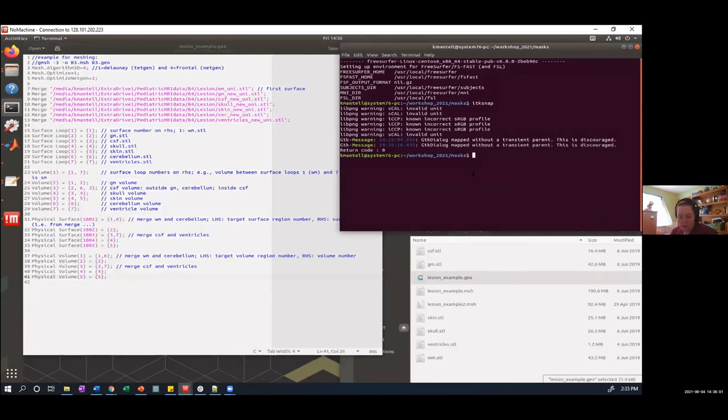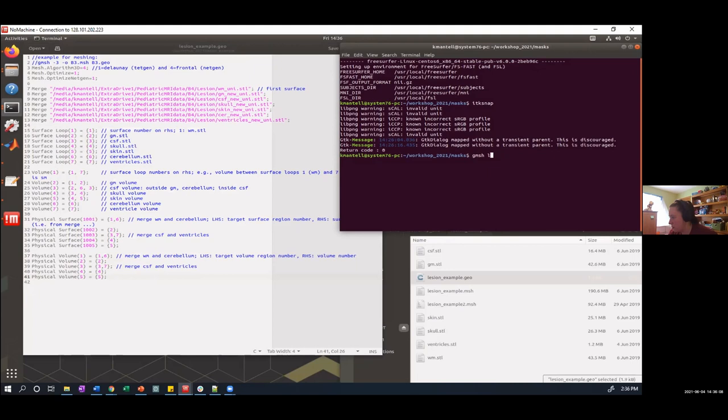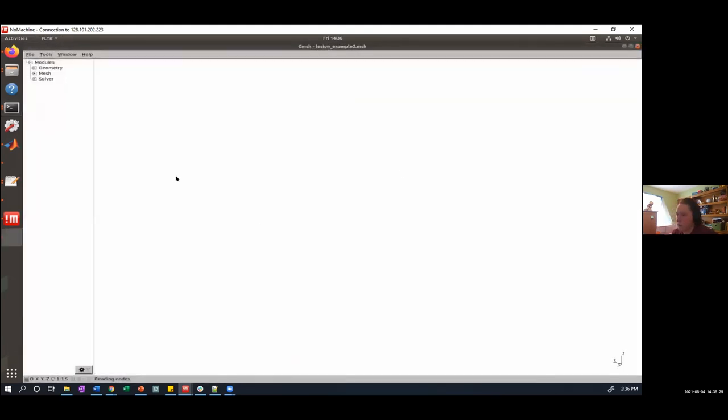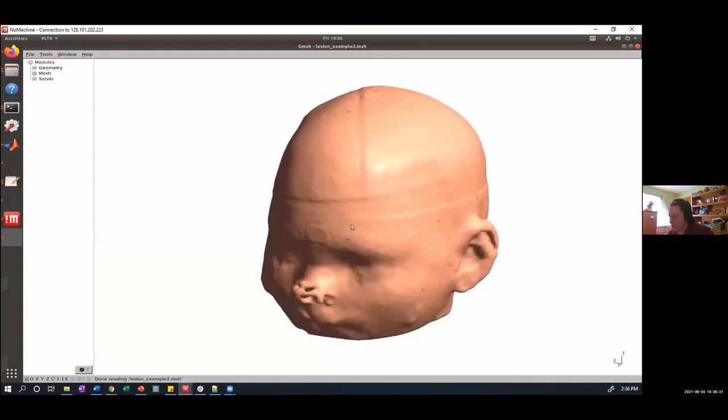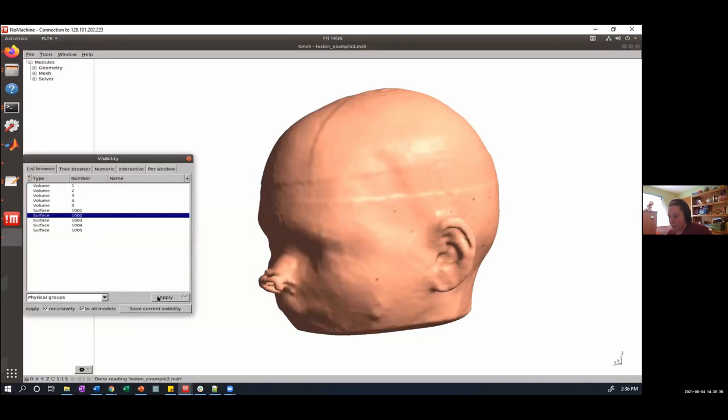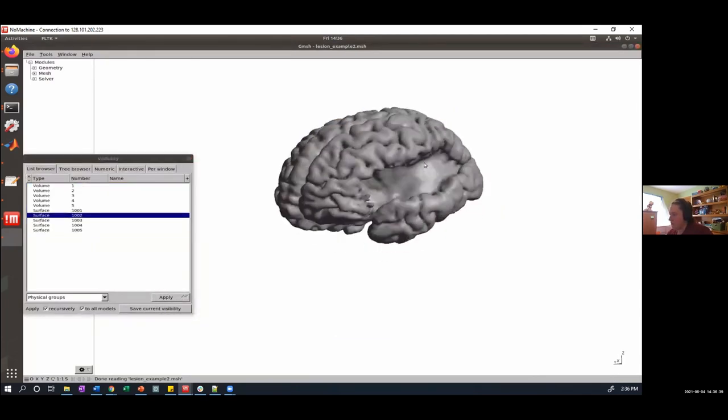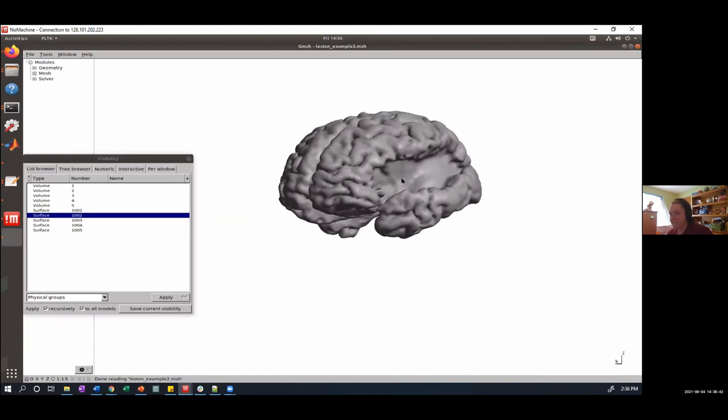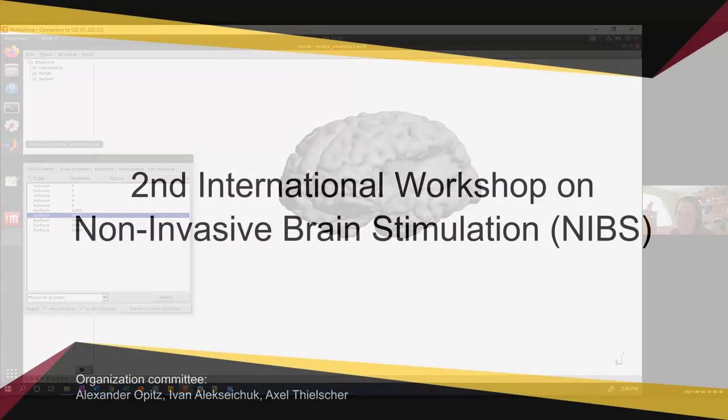And then, in the end, you end up with just a cool mesh that has a lesion, and everything worked out. So that's all. Just a very quick overview. Thank you.